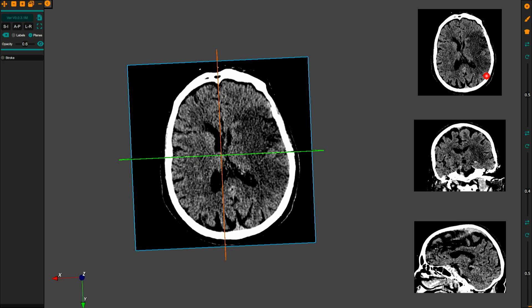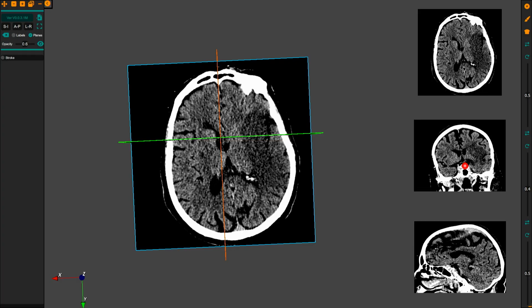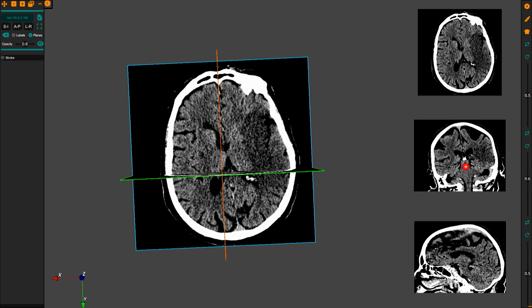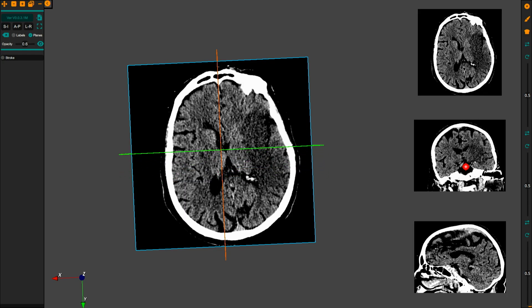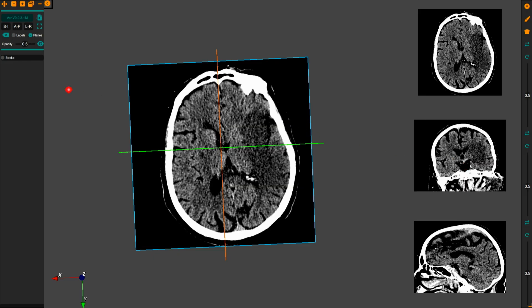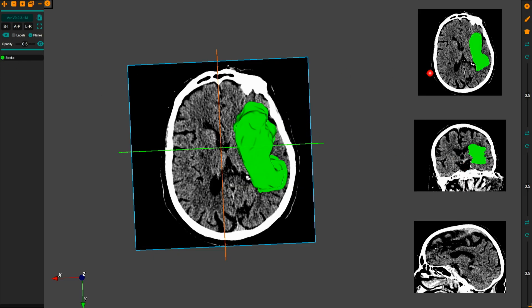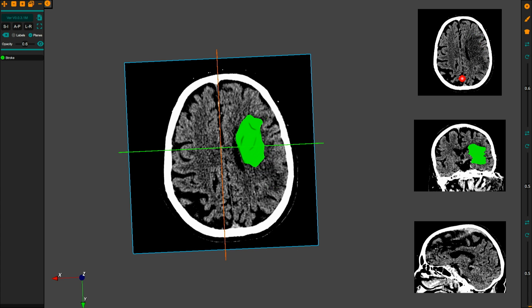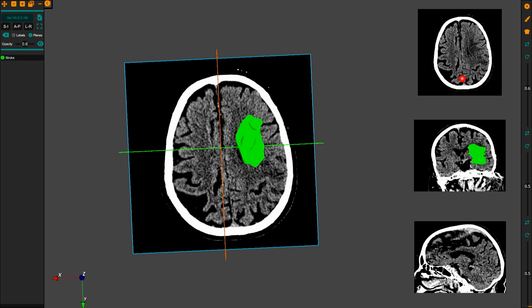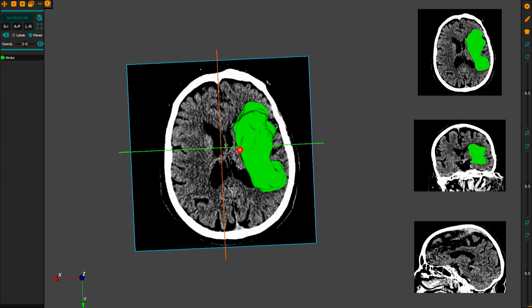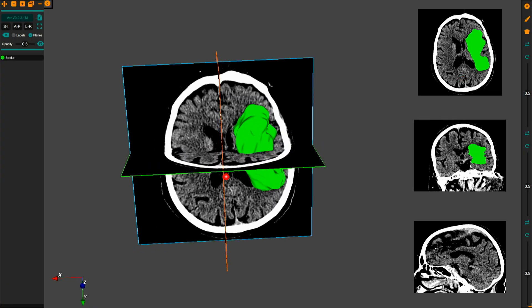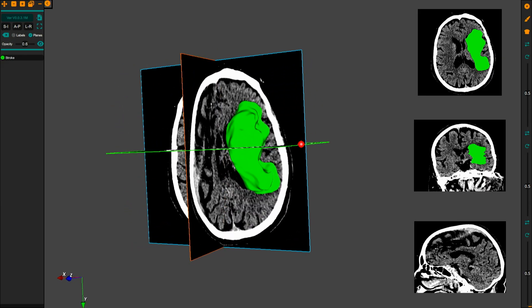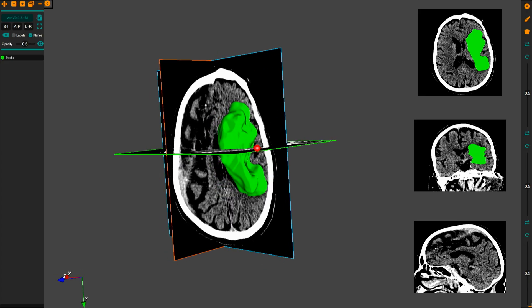When I am changing to axial or coronal view, you can see the plane changing. That exactly gives the idea about what plane we are in and what structures we are able to see. I can also put a color there, and you will appreciate that cut by cut it is outlining the infarct exactly, and then in all three dimensions it is showing you the total extent of the infarct. Eventually we will be able to calculate the volume also.